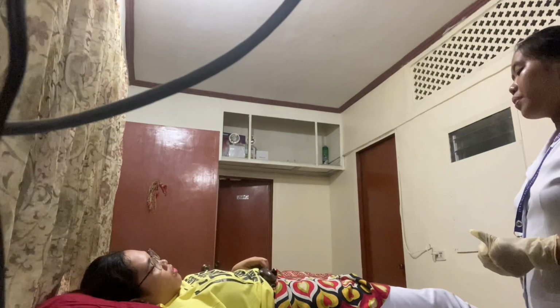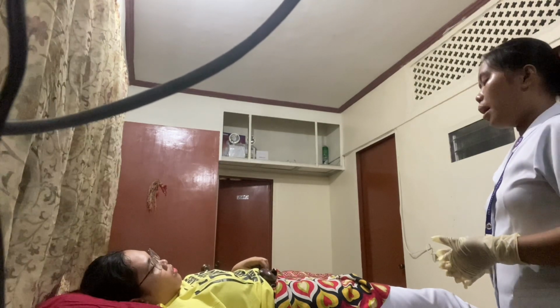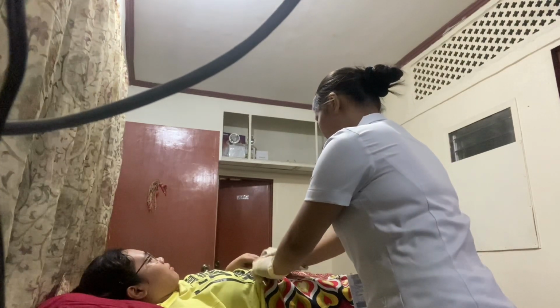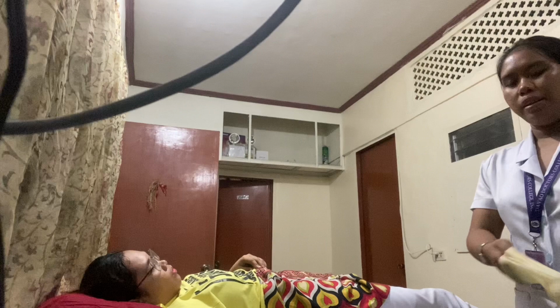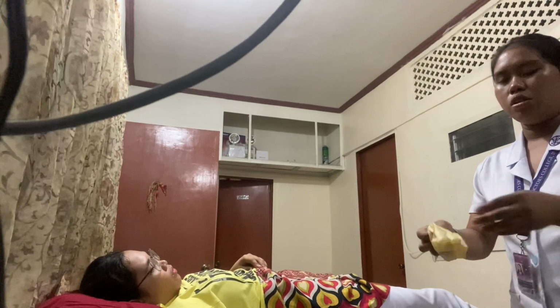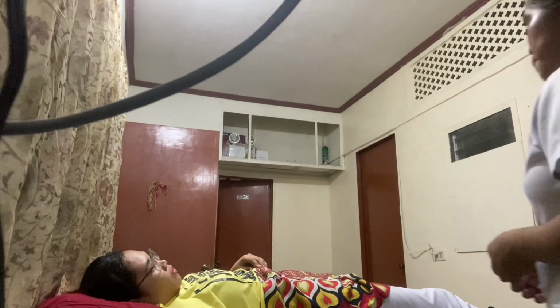And after that, assist the client into an appropriate position. And now do aftercare and discard the glove. And after that, perform hand hygiene to deter the spread of microorganisms. So I'm going to dispose of it into the garbage bin. And now assess the effectiveness, document the time, route, and also the client's reaction.